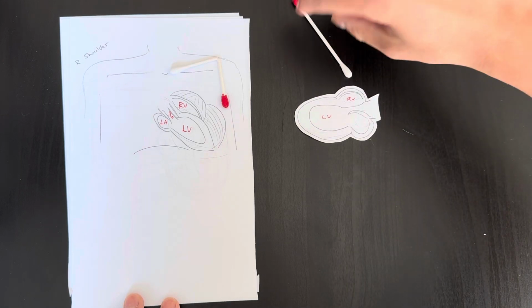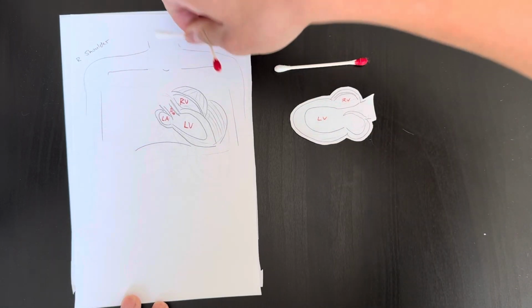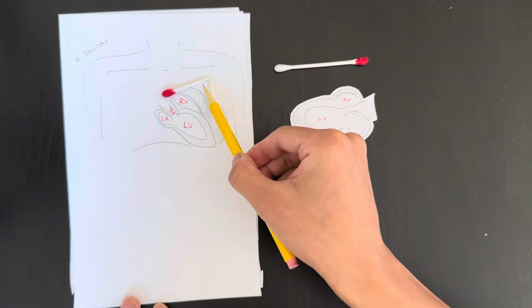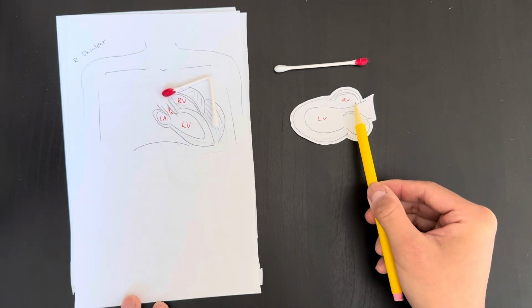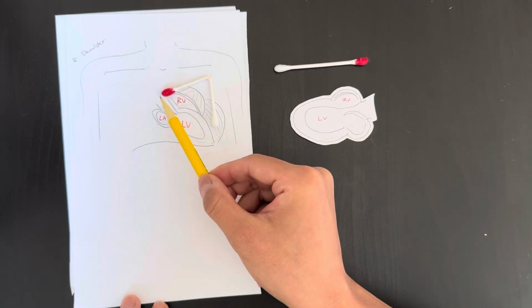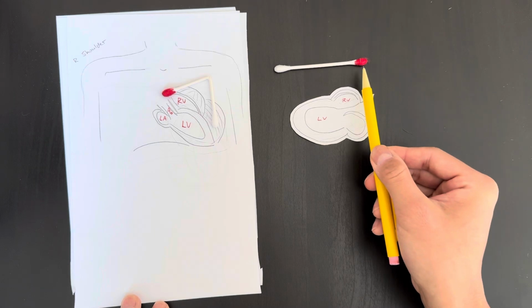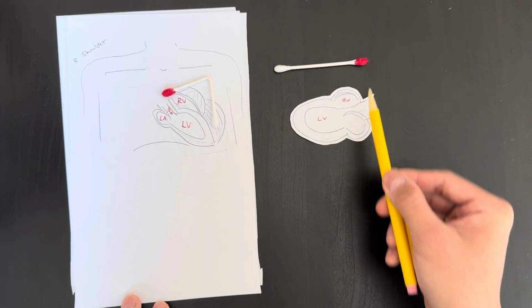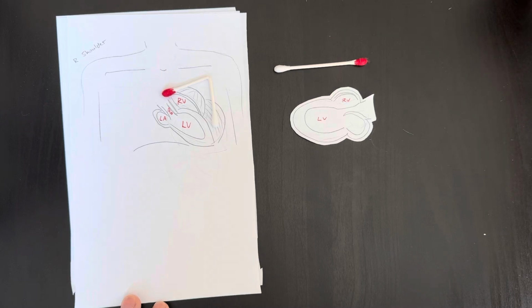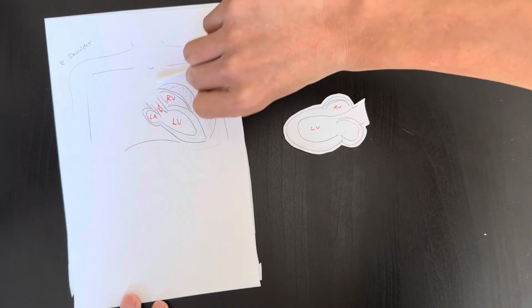If I was in a cardiology mode, and we're now pointed towards the right side of the heart, I would on my patient just flip this backwards, like this. So now my probe marker is towards their right, which is how it should look on the screen. And that's why people traditionally describe getting the parasternal long axis pointing towards the patient's right shoulder. So in cardiology mode, this is how I think about it. In cardiology mode, I want the probe marker away from the LV. So I scan my probe marker the furthest away from the LV. If I was in a traditional radiology POCUS mode, now I want it towards the LV, like this.